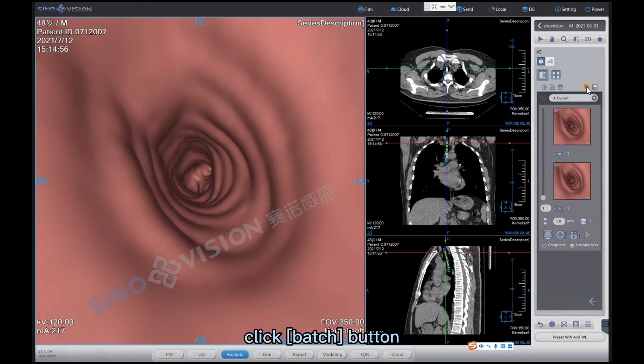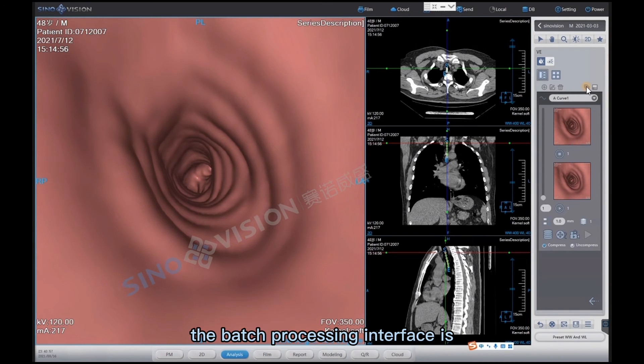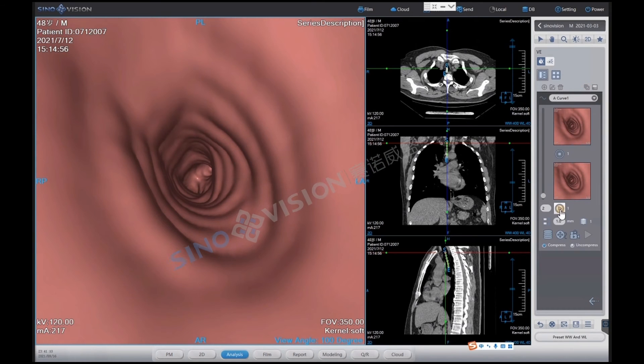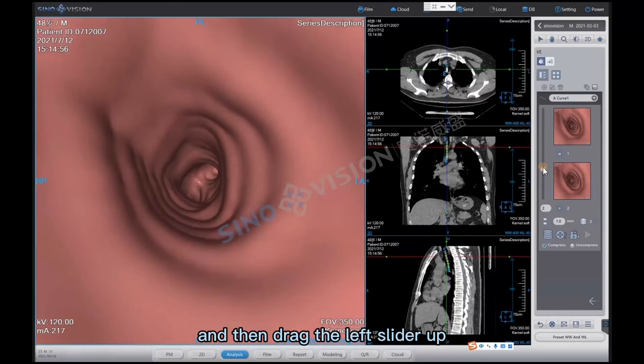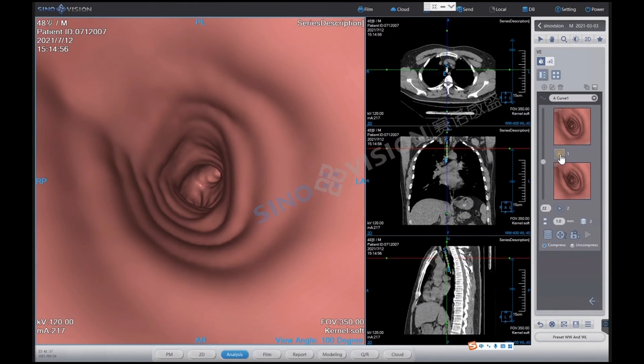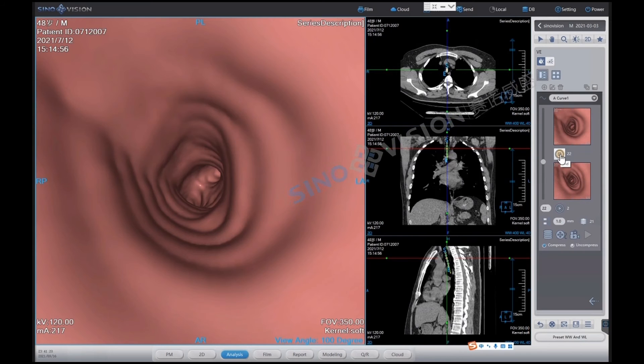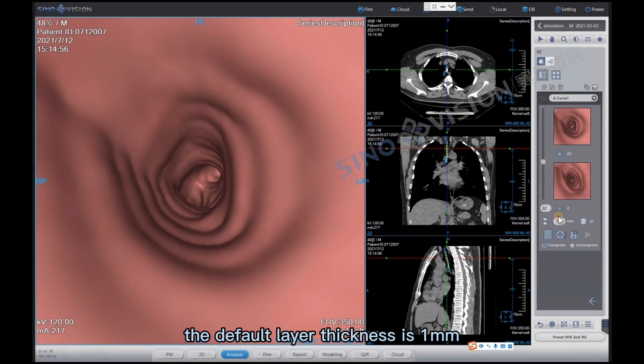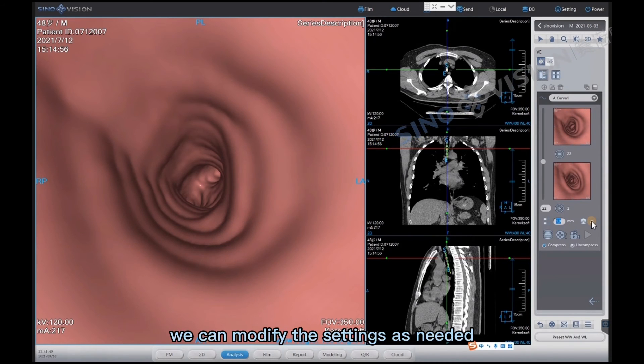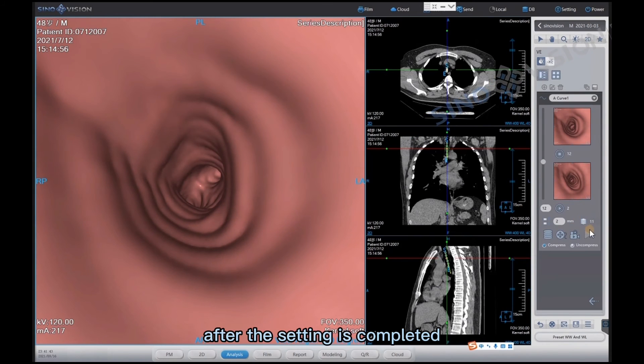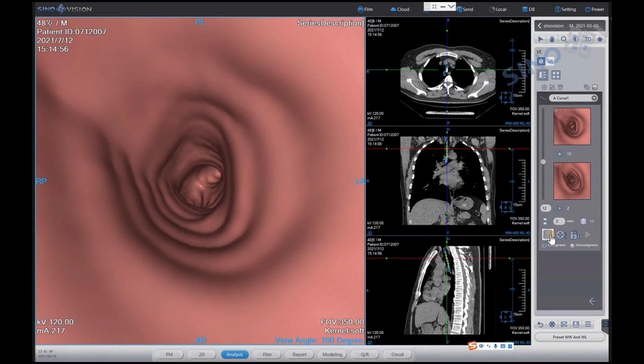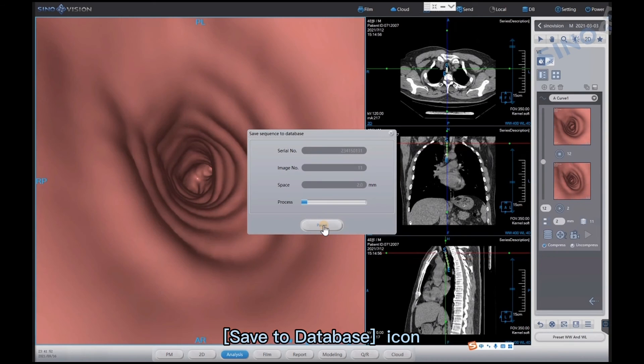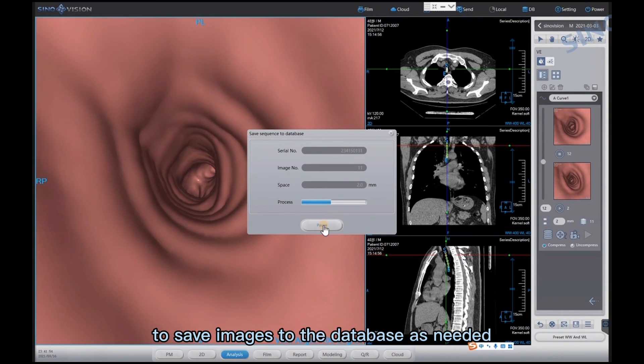Click the delete icon to delete the currently selected curve. Click batch button. The batch processing interface is opened for image processing and saving. Click the start icon and then drag the left slider up. Click the end icon. We can see the interval setting below. The default layer thickness is 1 millimeter. We can modify the settings as needed. After the setting is completed, the number of images will change accordingly.